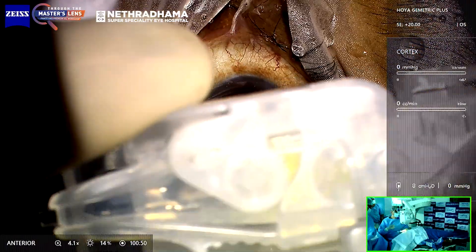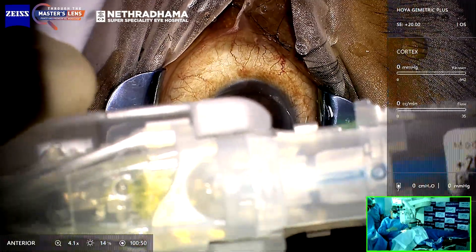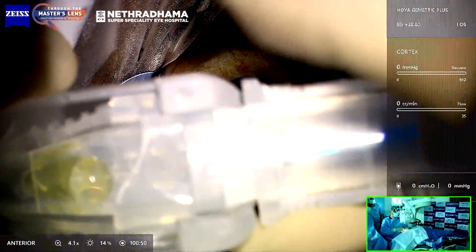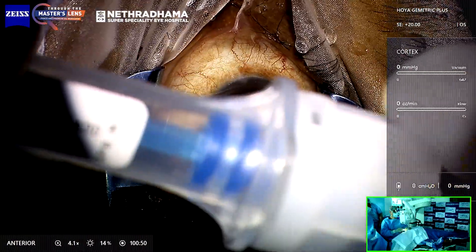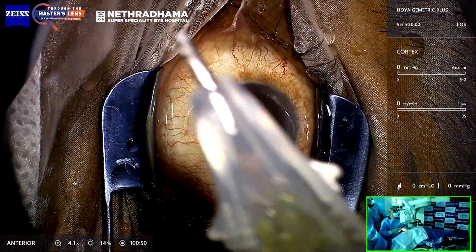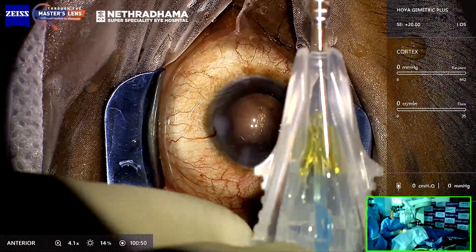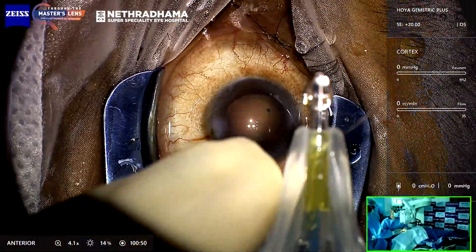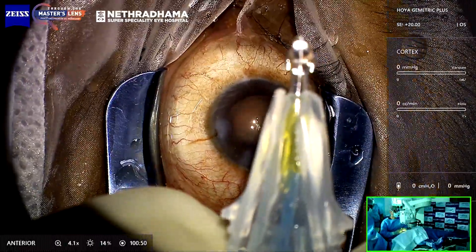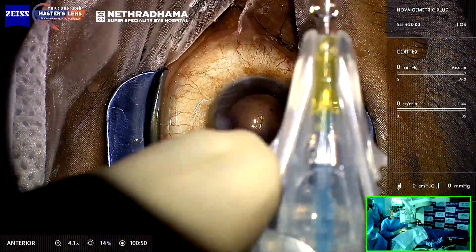You put in viscoelastic to fill the cartridge, and then there is a block here which you just lift off. Then you push the plunger forward and lift it off the case. You can either use the screw type or the plunger — here I'm going to use the plunger. You can see the lens is nicely folded in the cartridge. You can either use a wound-assisted or in-the-wound injection; if you want wound-assisted, you just pull the guard forward.